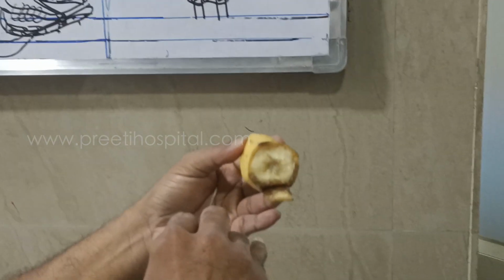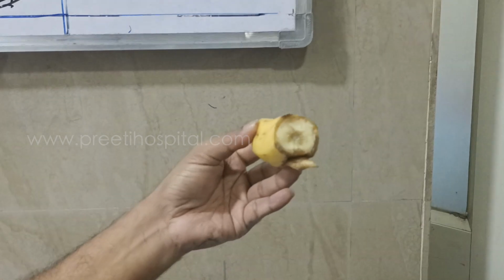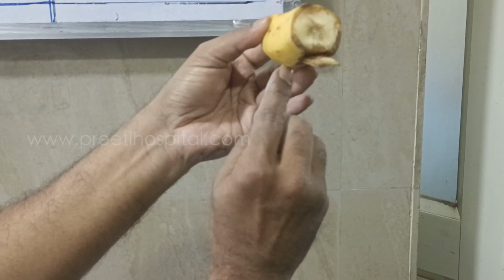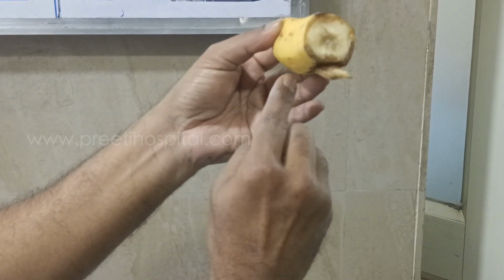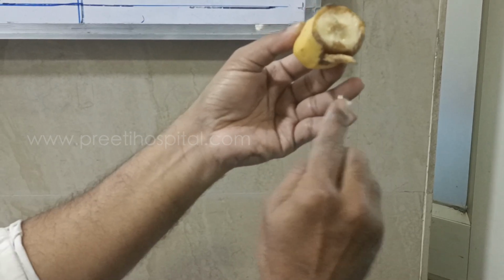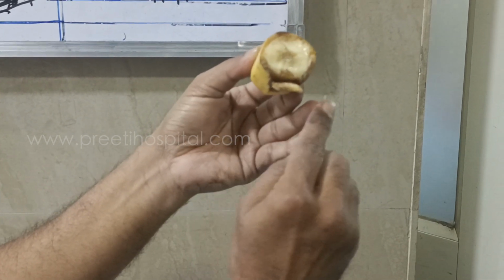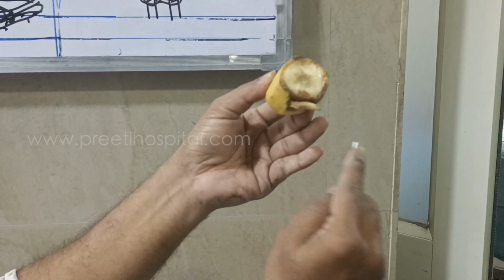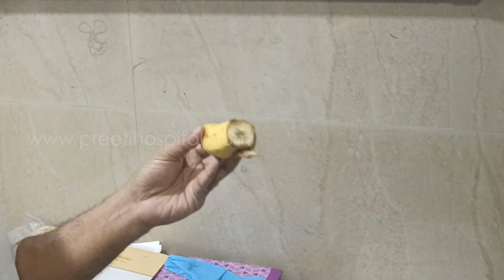Put the probe, bend fully, bend fully, bend fully. All are end firing. End means like this. 1, 2, 3. But the probe is like this. You have to tilt like this. 1, 2, 3. Lateral 1, 2, 3. Again 1, 2, 3, 1, 2, 3 like that. Where one is posterior, one is lateral. How many? 1, 2, 3, 1, 2, 3, 6. Sextant biopsy. That is not correct.